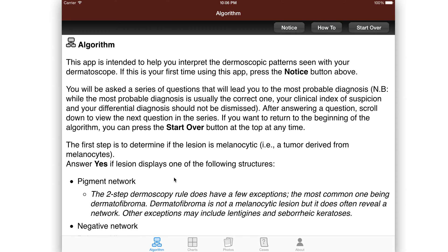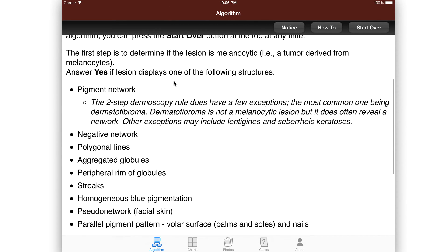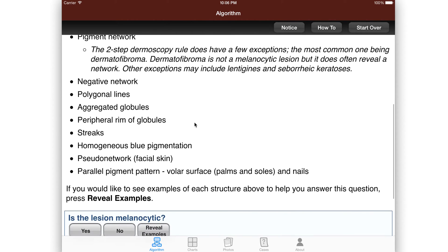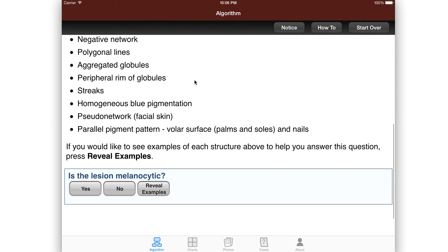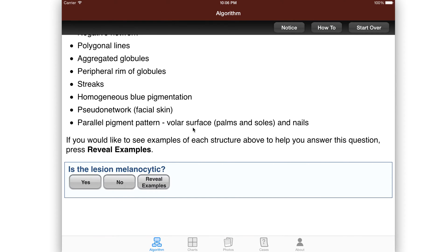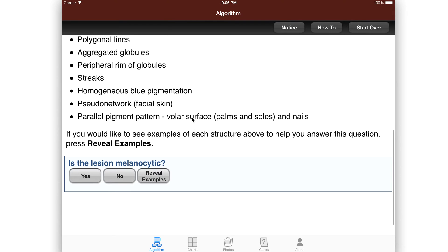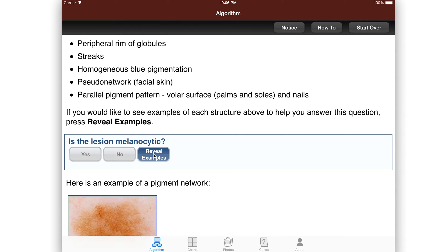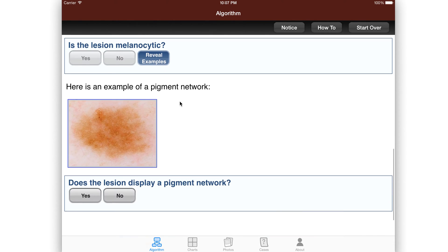If you follow the algorithm, it will teach you how to determine what is melanocytic by answering these questions. Does your image show any of these things such as pigment network or negative network, streaks, homogeneous blue patterns, all the patterns that are there. If you're following the algorithm, you answer the question: was it melanocytic, yes or no?